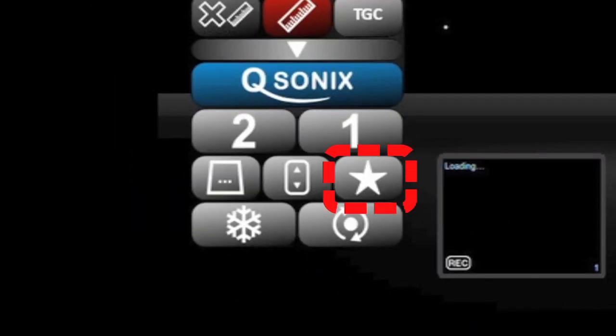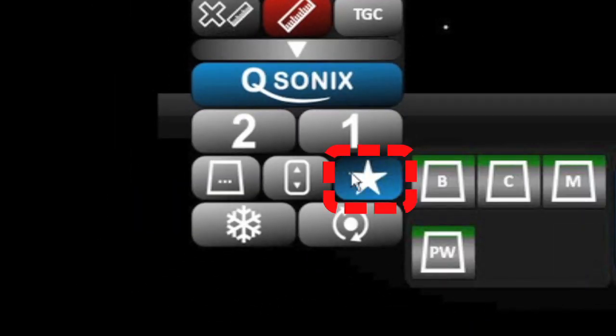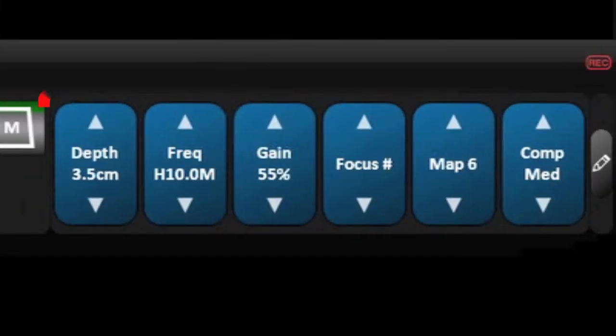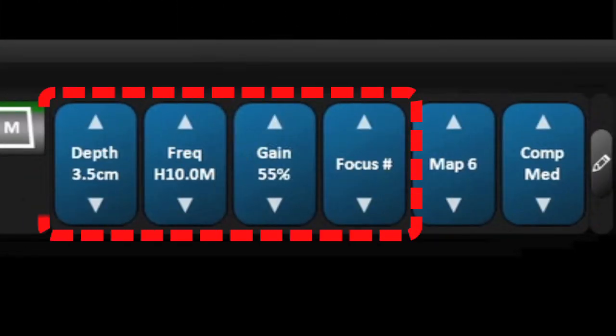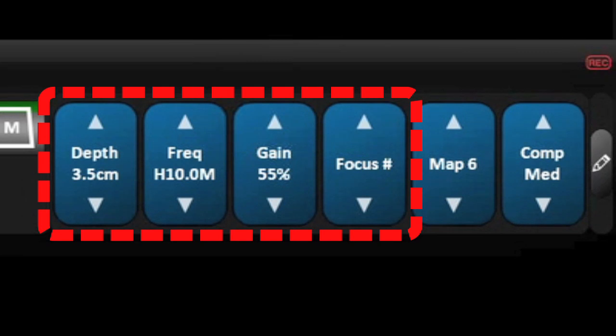Further changes to the image can be done by opening the favorites drawer to make changes to the depth, the frequency, the overall gain, or the number of focal points.